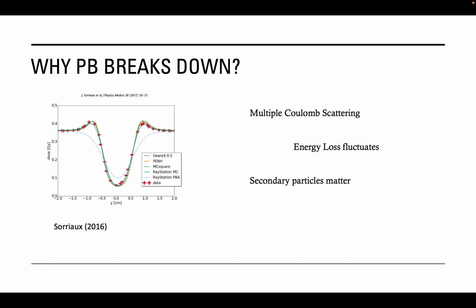And then pencil beam is not able to incorporate the extra dose which comes from outside of the beam, from the secondary particles, which get generated, mostly secondary protons and electrons and neutrons, but not that much. And the last is that interface effects dominate.